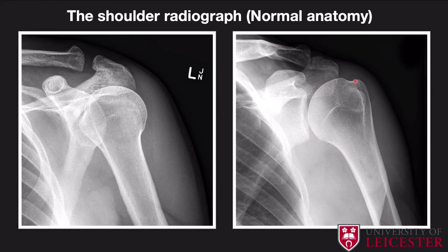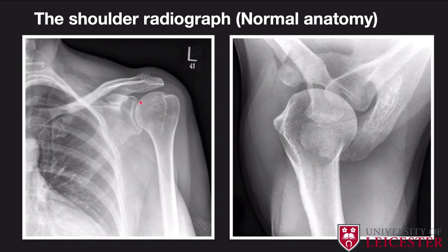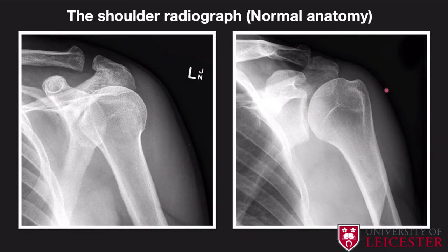Moving on to external rotation: an externally rotated shoulder is quite similar to the normal neutral position. You can see how well-demarcated the greater tuberosity is. These views are useful for looking at the greater tuberosity particularly. Sometimes you can see what we call a Hill-Sachs defect — when you have an anterior shoulder dislocation, the posterolateral humeral head dislocates anteriorly, hits the inferior glenoid, and causes a little depression or indentation. That's what we call a Hill-Sachs defect. If there's not much overlap of the humeral head and glenoid, think about whether the patient has externally rotated and whether assessment of the posterolateral humeral head is possible.